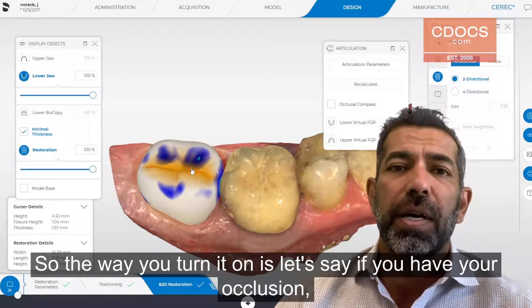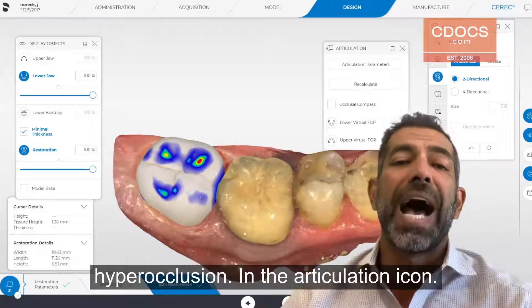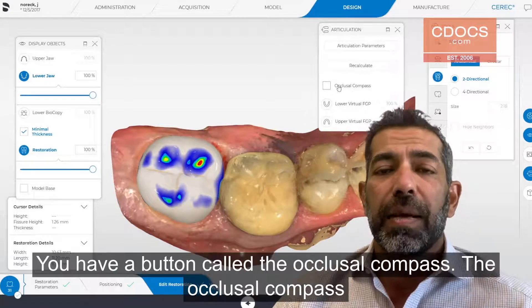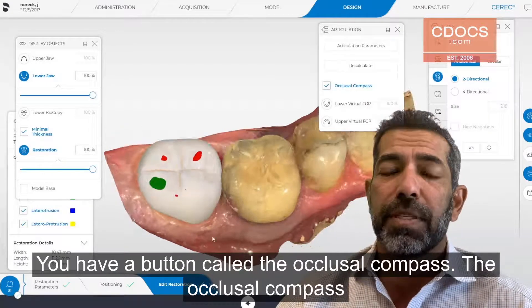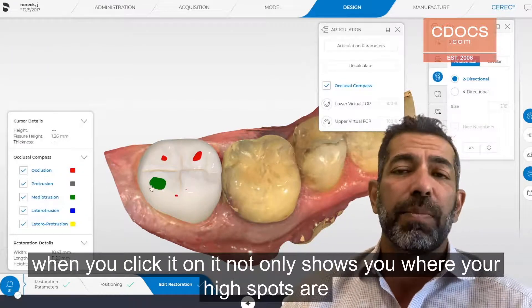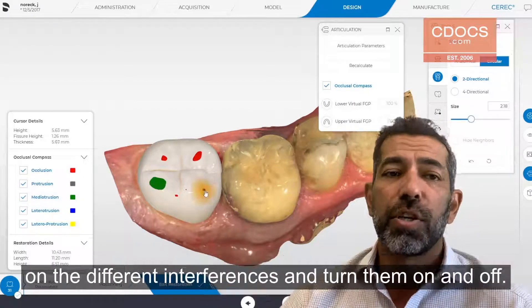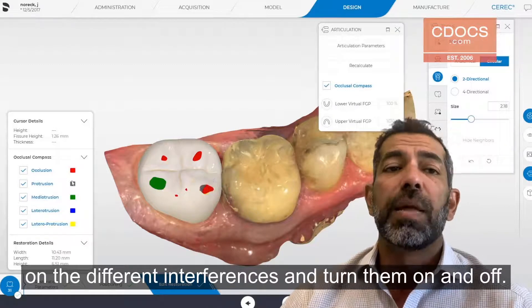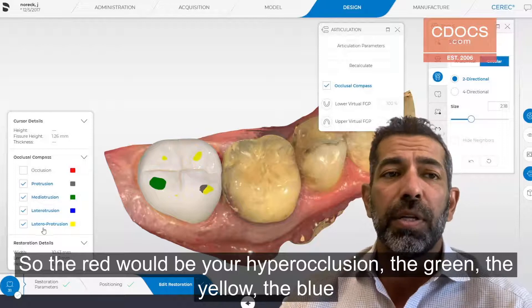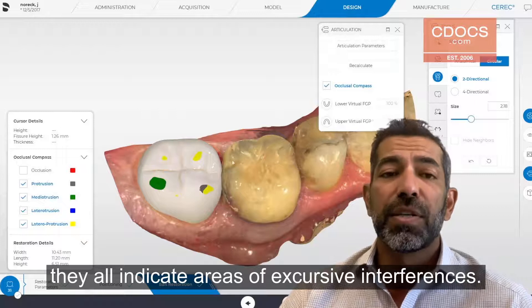To turn it on, let's say you have your occlusion — we're going to take this crown and make it just hyper occlusion. In the articulation icon, you have a button called the occlusal compass. When you click it on, it not only shows you where your high spots are, but it also shows you where all the interferences are. You can turn the different interferences on and off. The red would be your hyper occlusion, and the green, yellow, and blue all indicate areas of excursive interferences.